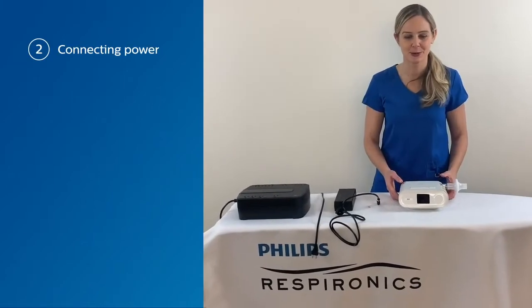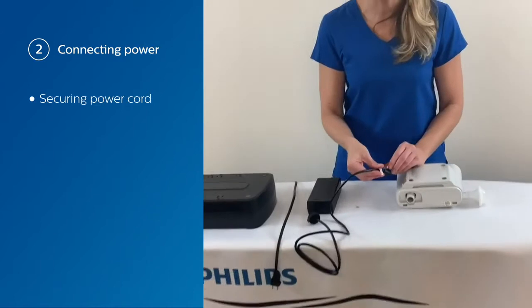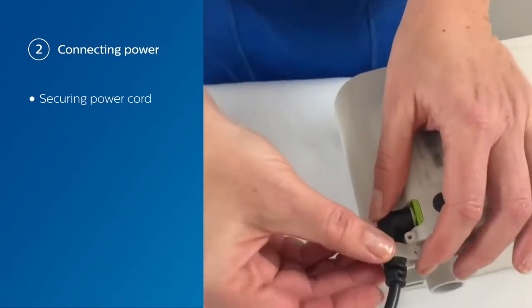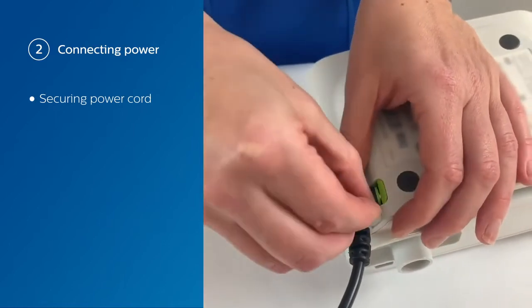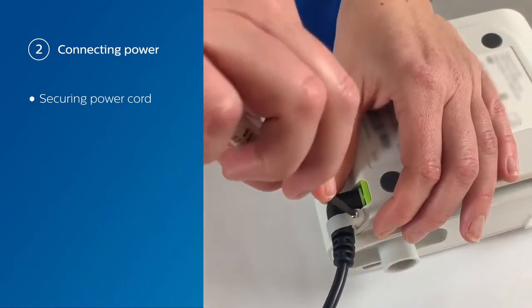Next, we're going to go through how to apply power to the device. Flip it over, take your power cord with the cord clamp, connect that in here. Then you have to take the screw and your screwdriver and tighten that.